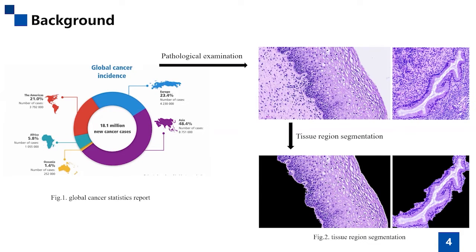However, the traditional manual segmentation method is limited by being time-consuming, unstable, strongly subjective, and having a high error rate due to visual fatigue. Developing an intelligent automatic algorithm to efficiently segment different tissue is crucial for the development of pathology-assisted diagnosis.